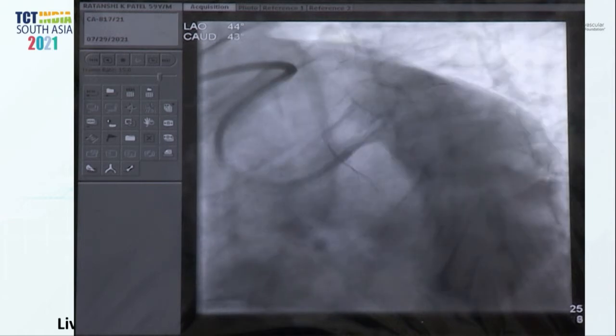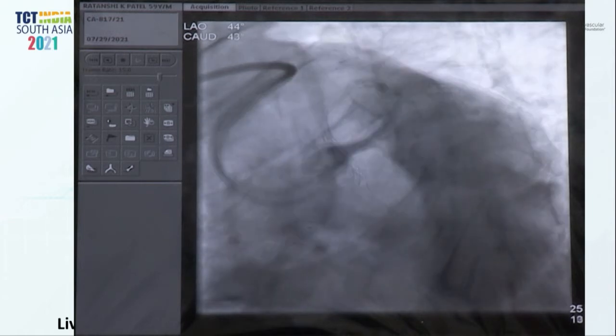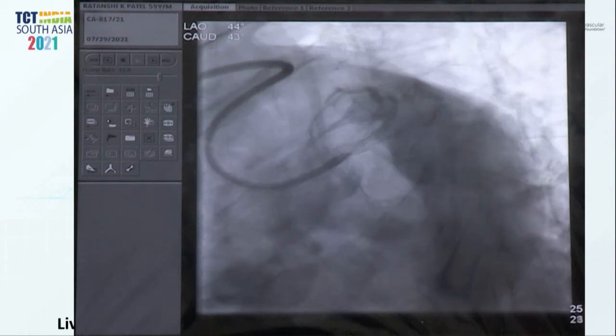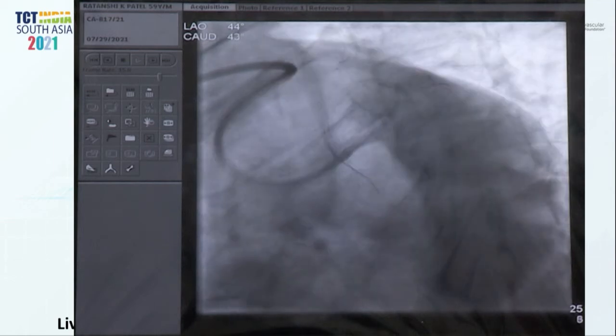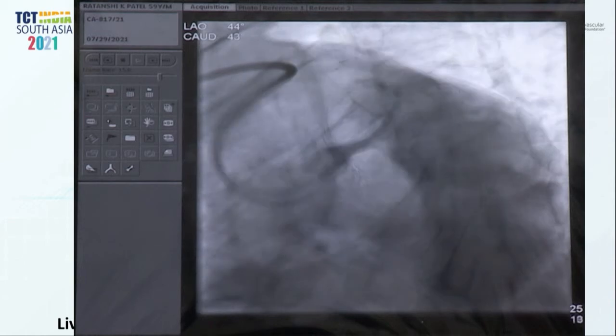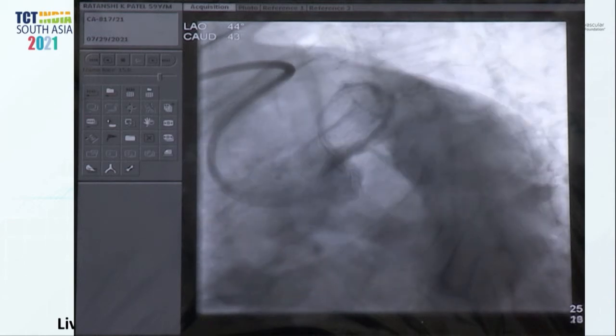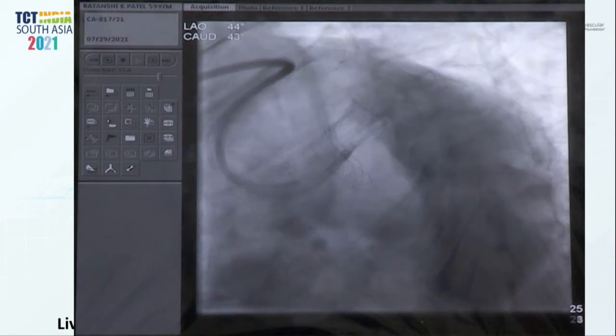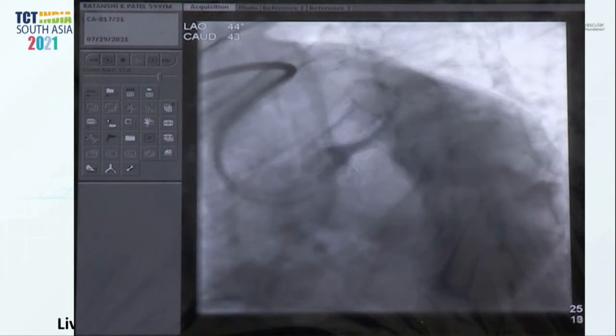But also we need to mention, if you see only the proximal vessel, sometimes you could end up, though these later generation stents are very good and compliant, they adjust according to the diameter. But if you stretch it too much, probably edge dissections could happen. Where the proximal and distal vessels are different, you could select somewhere in between, very low pressure, and then dilate proximally with a bigger size balloon. That is a normal routine approach.